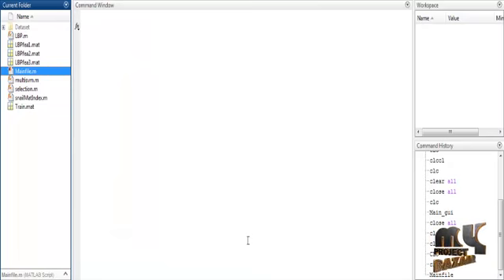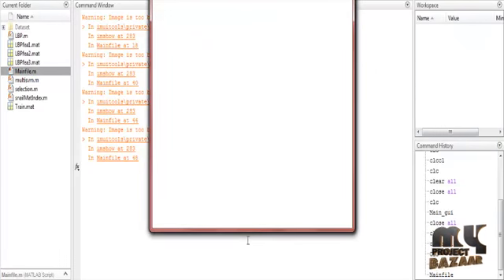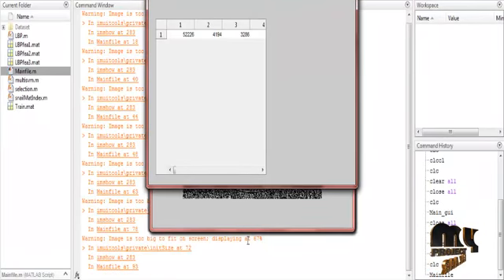As I already told, there are 6 modules. First, get the input image, and second, the pre-processing. In the pre-processing step, we are using histogram equalization and then RGB separation. The next process is feature extraction, where we are using LBP, and then feature selection, where we are using the genetic algorithm. Finally, in the classification process, we are using the SVM classifier. So these are the 6 modules in the process. I will discuss them one by one.